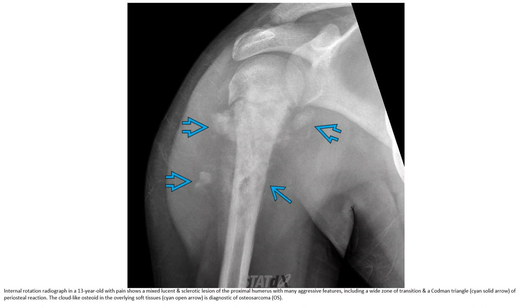Internal rotation radiograph in a 13-year-old with pain shows sclerotic lesions of the proximal humerus with soft tissue mass. Aggressive features include a wide zone of transition, a Codman triangle, and periosteal reaction.